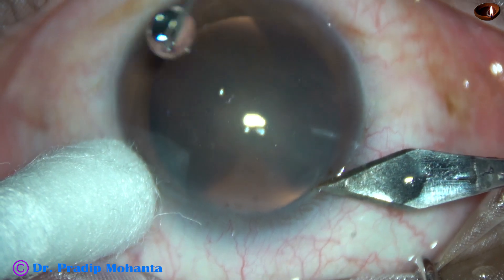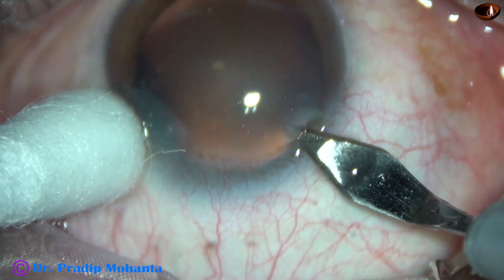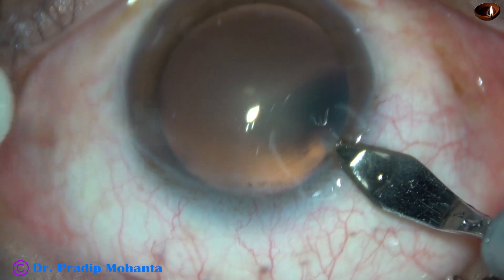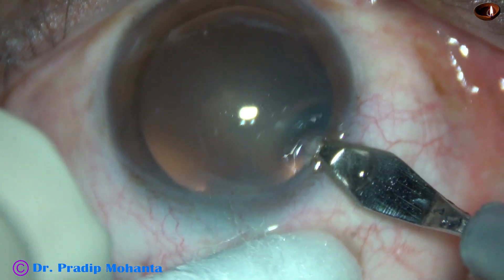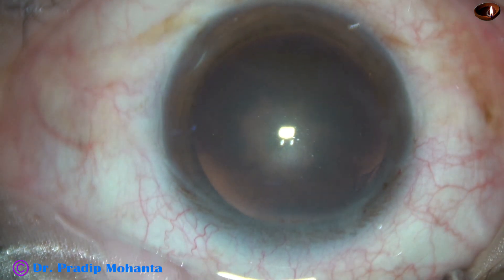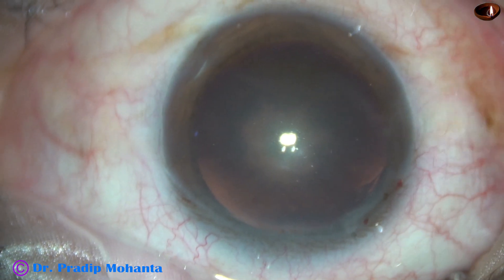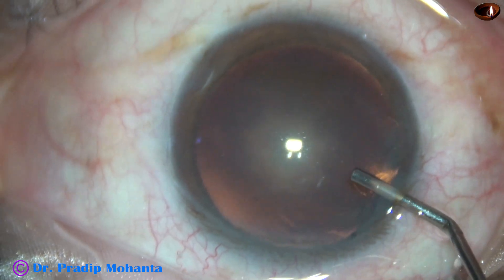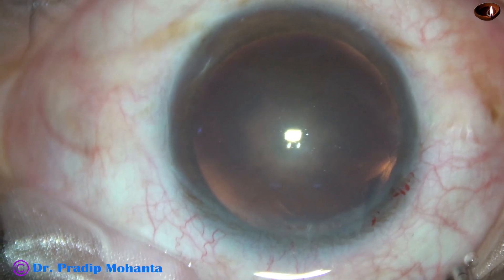This is the main incision with a 2.8 mm steel keratome on the posterior aspect of the limbus. And now the anterior chamber is filled up with 2% hydroxypropylmethylcellulose.